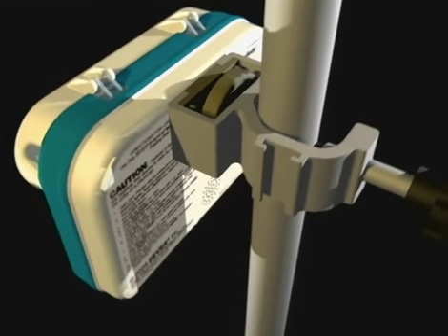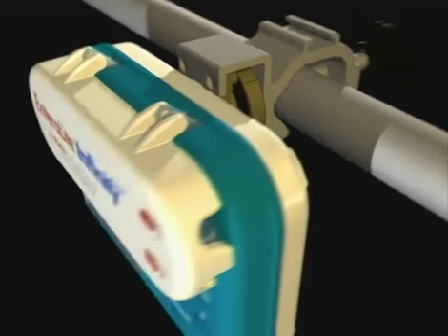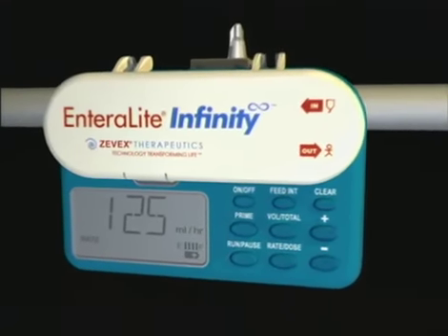To rotate the pump into different positions, simply loosen the gray wheel, then retighten it when the pump is in the desired position. You'll find the unique adapter cover holder on the back of the clamp very helpful as well.